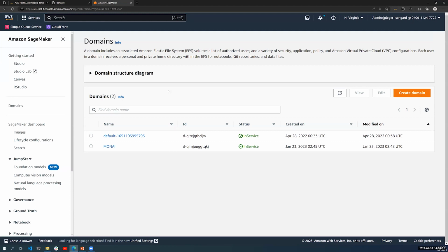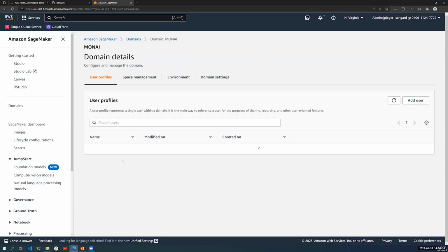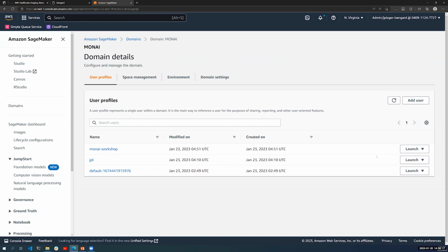And then just like you have been using, I believe, Google Colab this morning, where you could have something very similar to a Jupyter notebook, or in fact, having a Jupyter notebook, you can have the same concept with SageMaker. So SageMaker basically allows you to develop, train your models, but also to run them in production. So I'll select the MONAI notebook, and then that's the one.